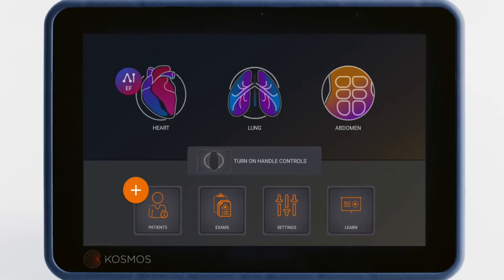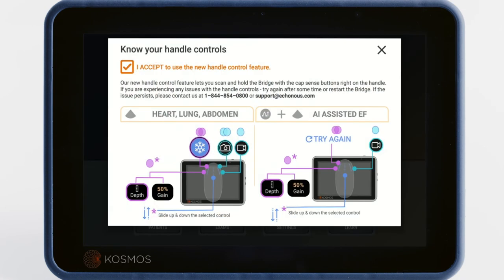Turning on handle controls is optional. To toggle handle controls, simply press the handle control button on the home screen.